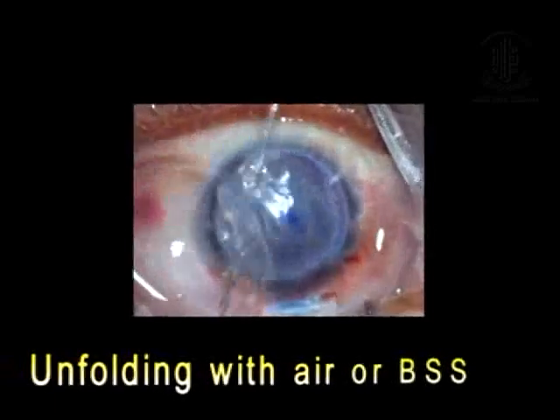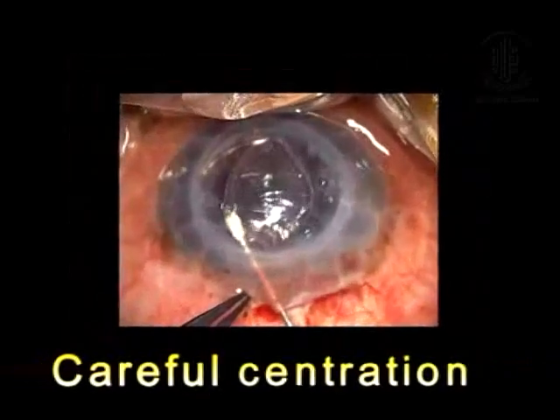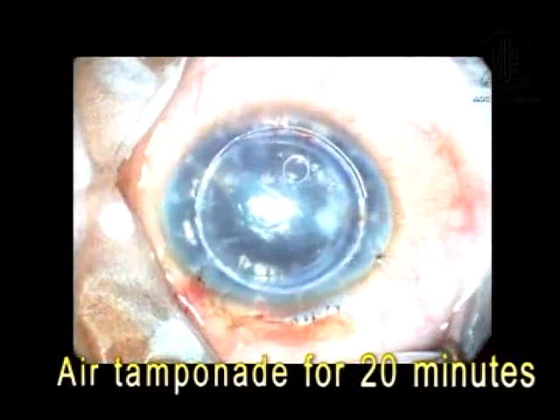unfolding of donor tissue with air or BSS, careful and perfect centering of the donor tissue, and air tamponade for 20 minutes.